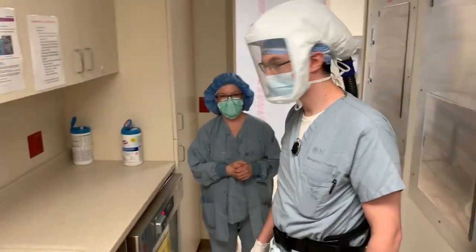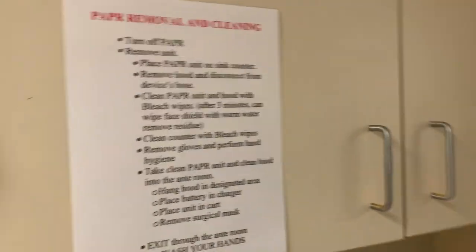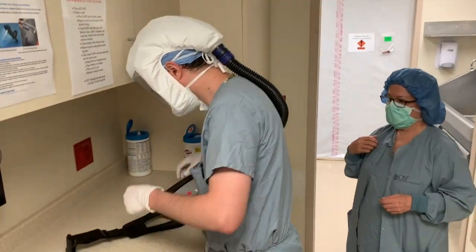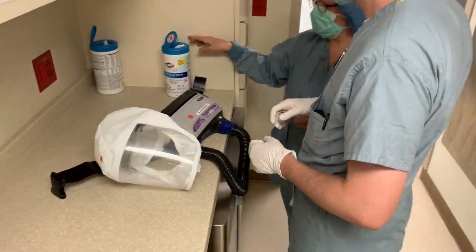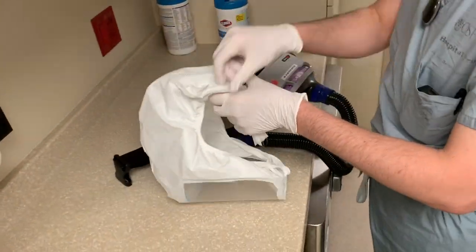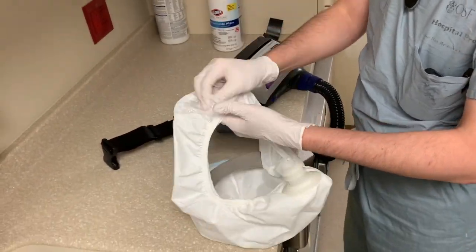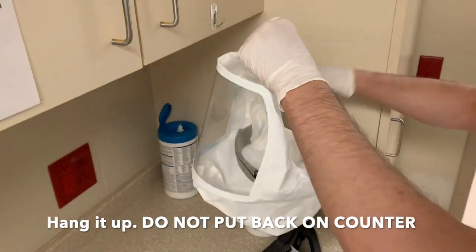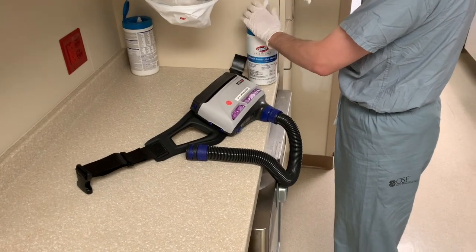The instructions are on the counter here. There will not be someone to guide you or buddy you through this process. You have to take it seriously because you must clean this — no one else will clean it for you. The next person using it depends on you. That's why you are wearing gloves. You need to wipe down the entire hood inside and out with a bleach wipe, thoroughly, in all the cracks and crevices, then hang it up so it's not touching the counter.